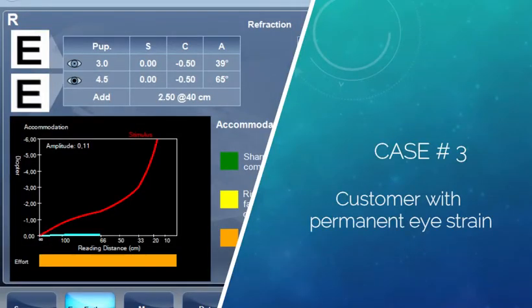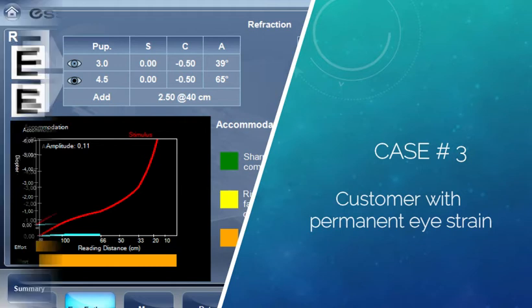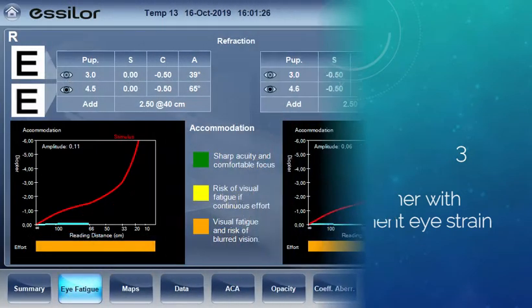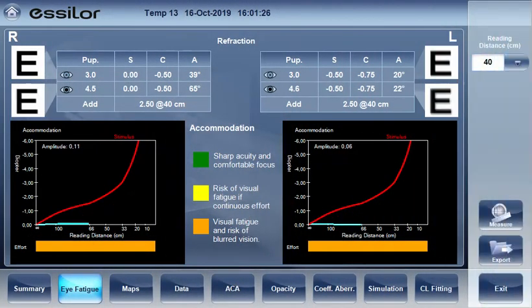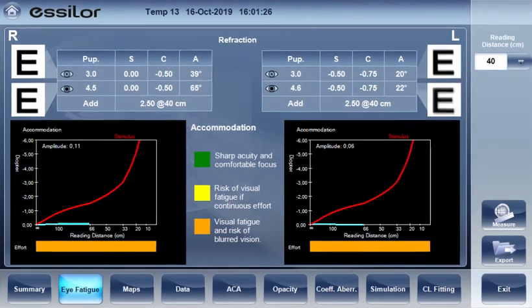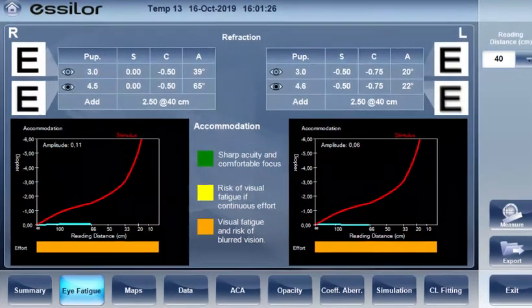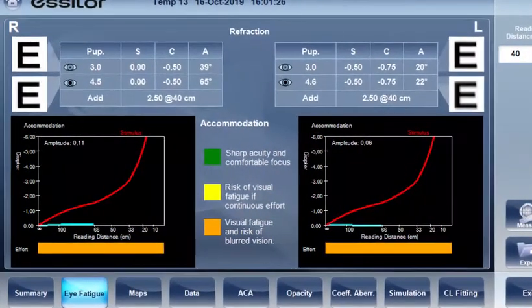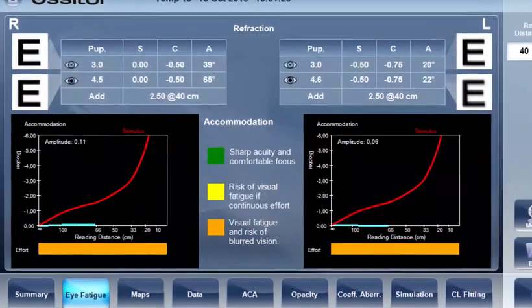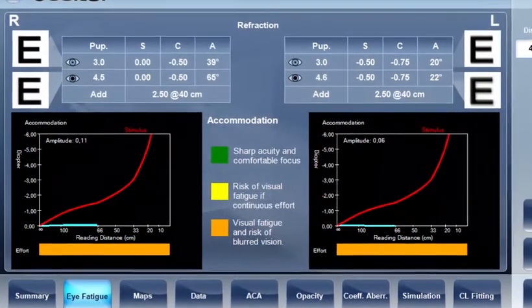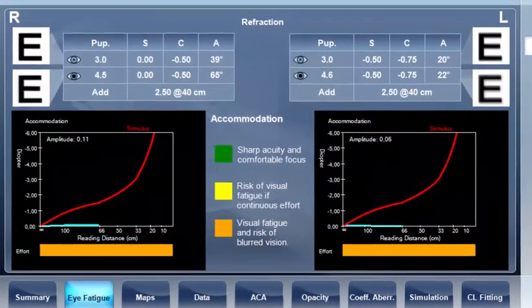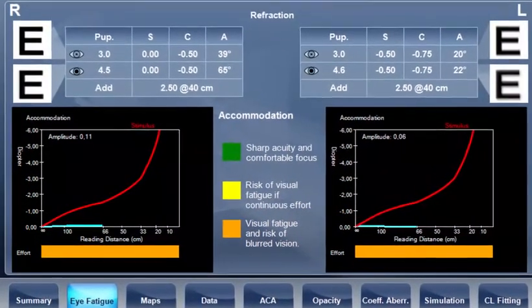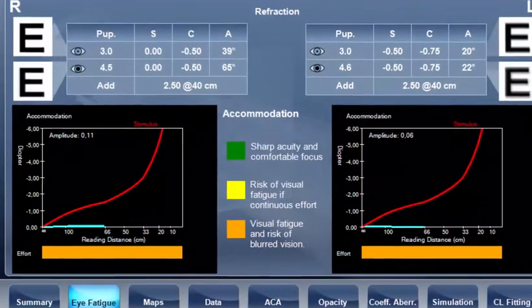Case three: patient with permanent eye strain at every distance. In this case, the whole bar is orange, meaning that the patient has visual strain and risk of blurred vision at every distance. After determining the subjective refraction, this patient may need progressive lenses.